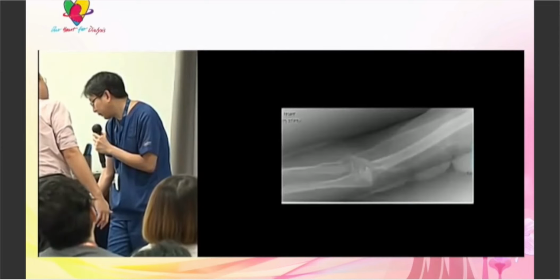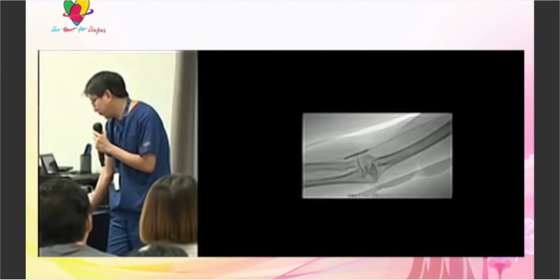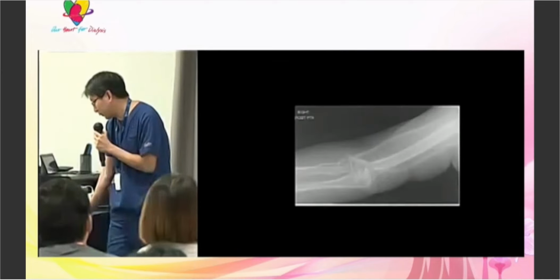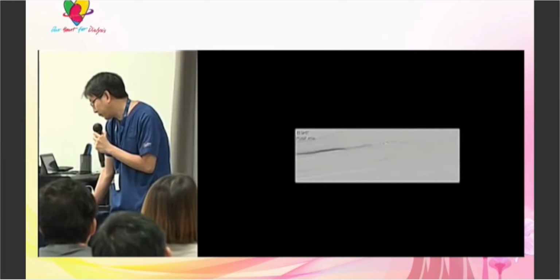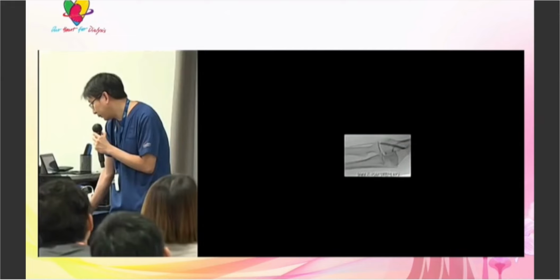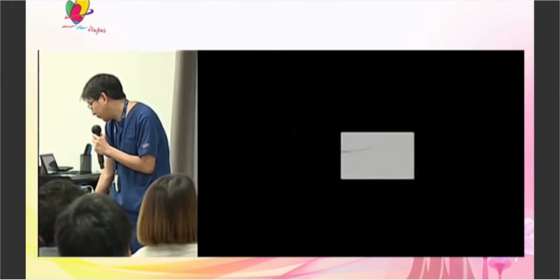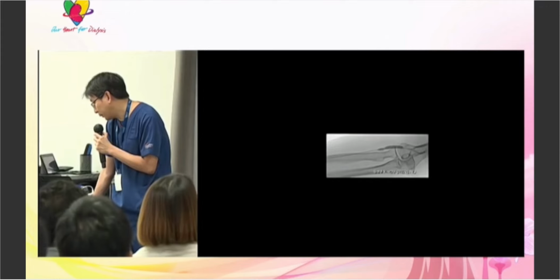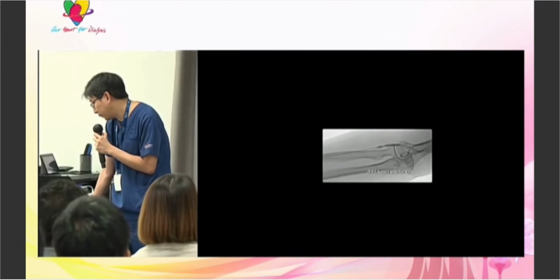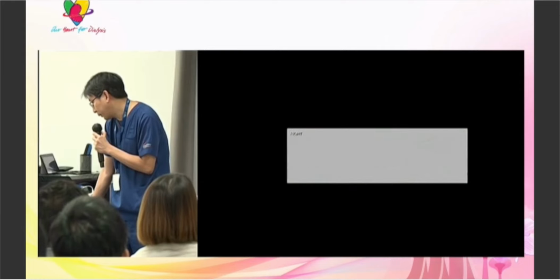Okay, the angiogram is reversed, but essentially what we did is a Sterling balloon across the anastomosis and perforator. It looked like that after that. And then treated the outflow. And I think ultimately we needed to do a cutting balloon. Yes, so we had to use a cutting balloon because it didn't quite efface fully. So in the end, I used a cutting 5 and then I tried to post dilate with a 6 and it looks better after that.